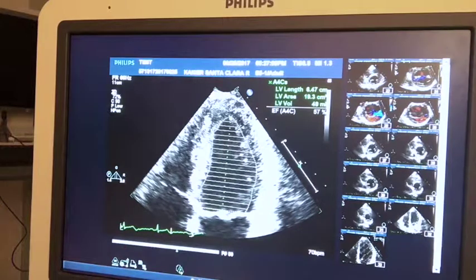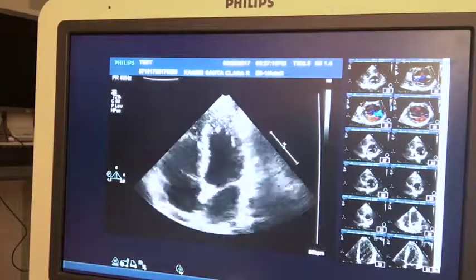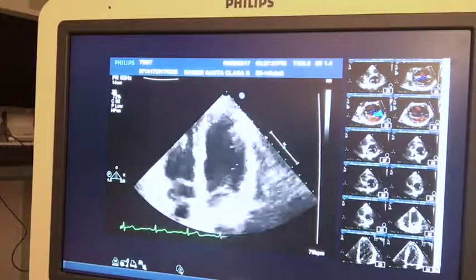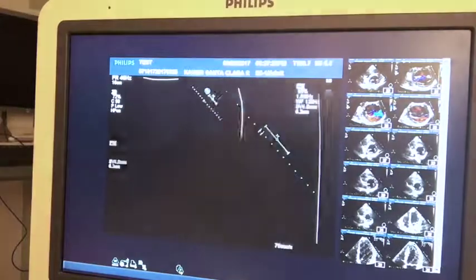Okay, so if it's a clear picture like how this is really nice and clear, pretty easily I can figure out where the boundaries are, and you want to just be consistent, because then you can fine-tune based on input from your cardiologist.